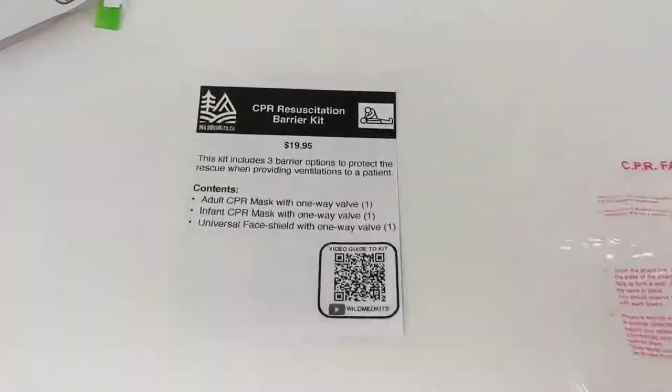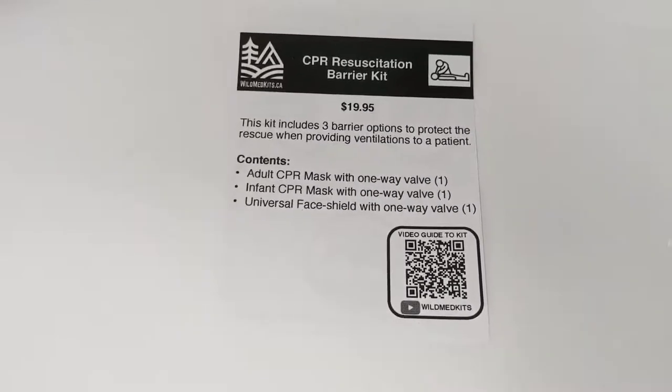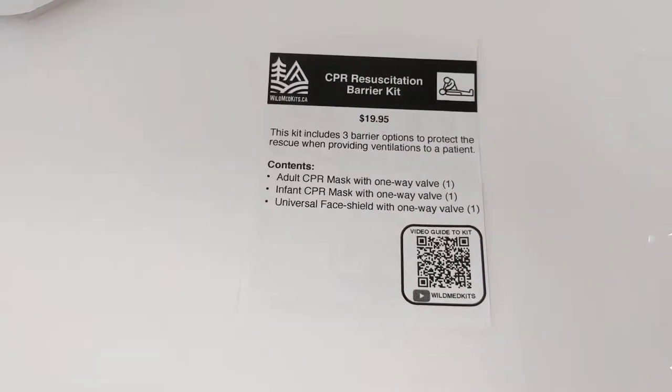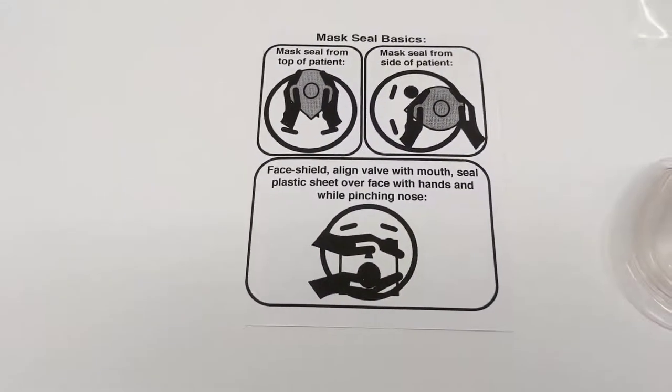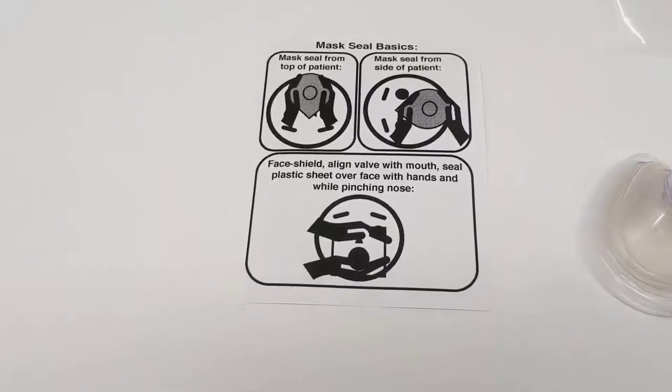This kit comes with a contents card going over the contents of the kit, as well as a QR code linking to educational videos related to the gear in the kit. It also comes with a basics guide on the back of that contents card, just to review some basics of how to use the gear.